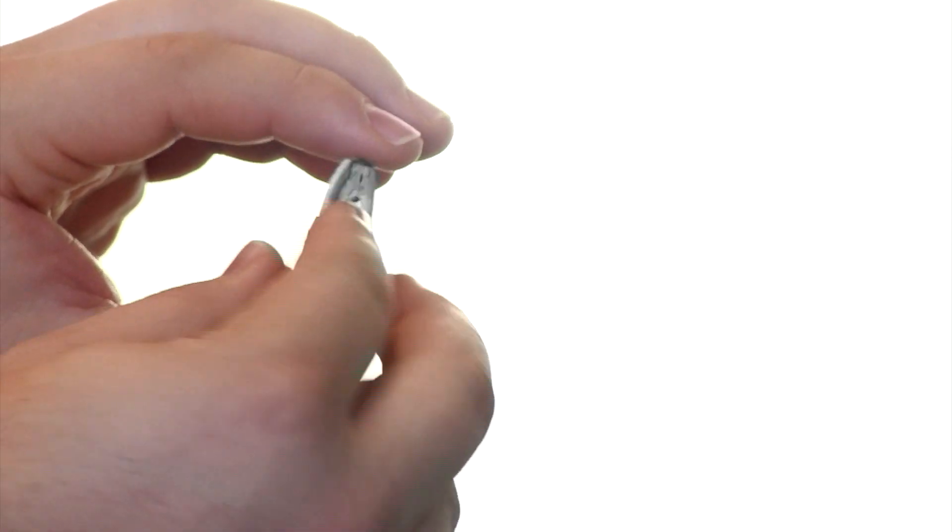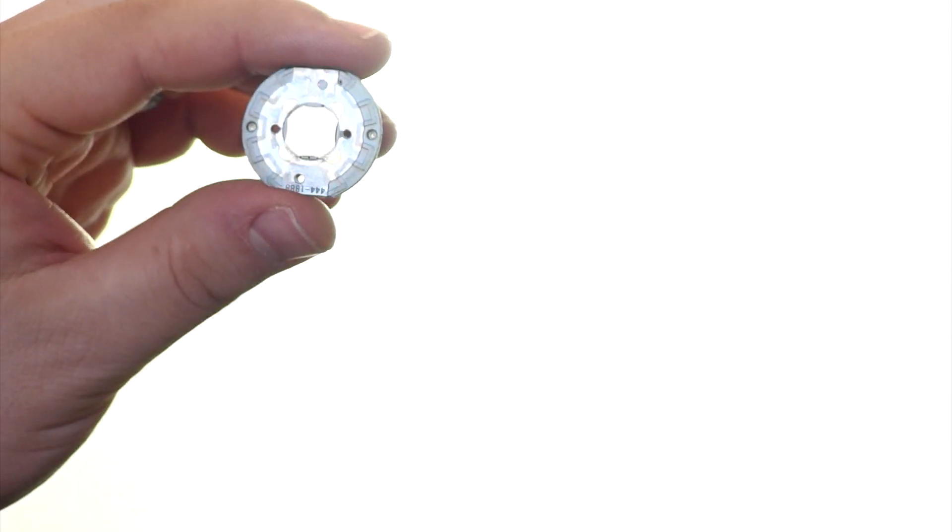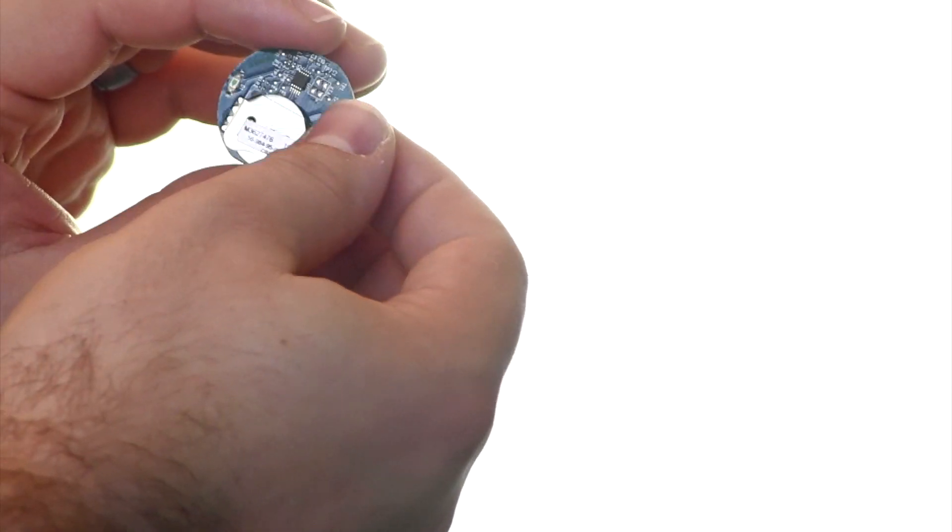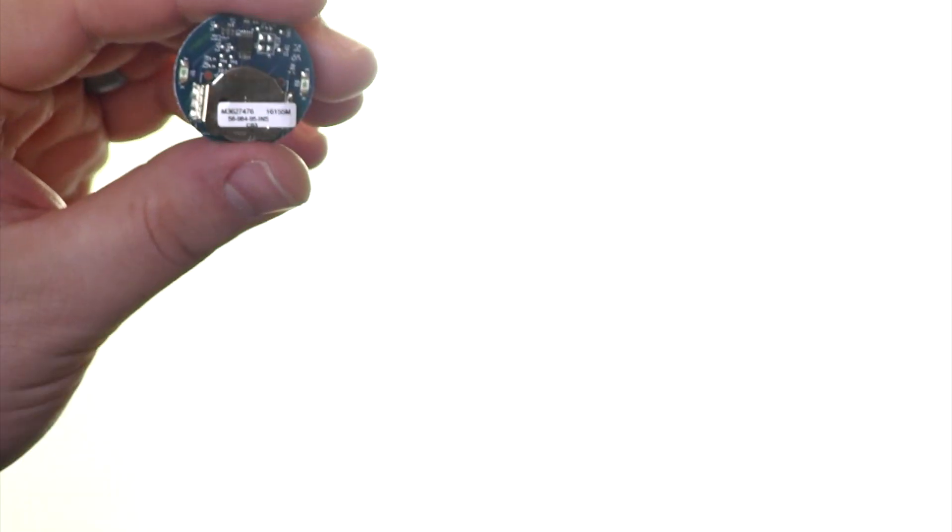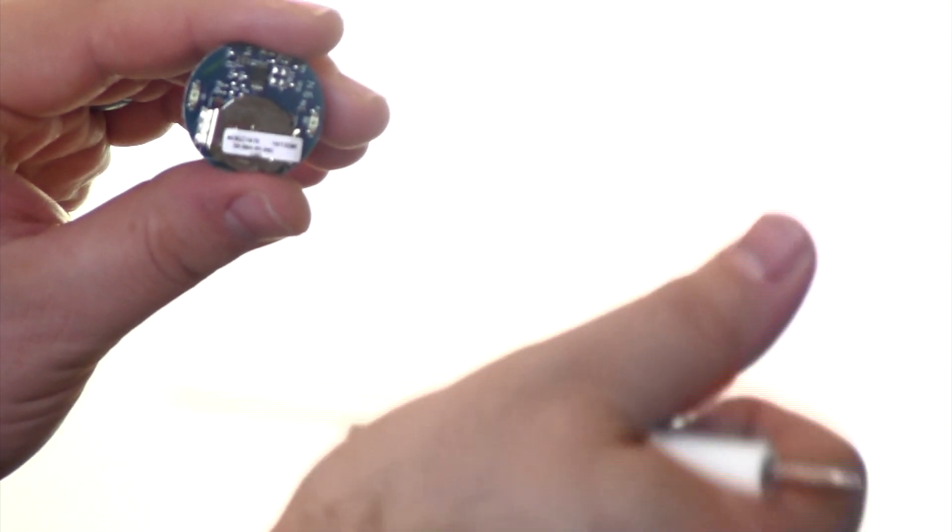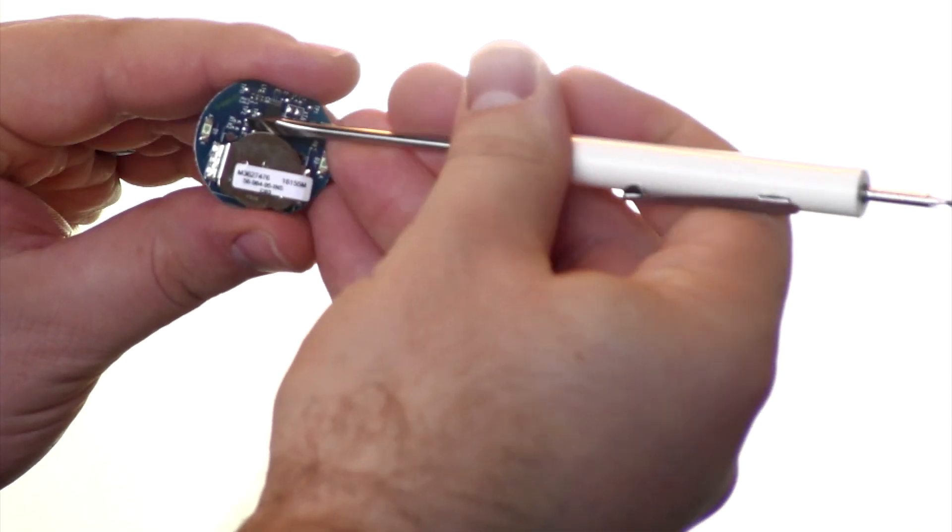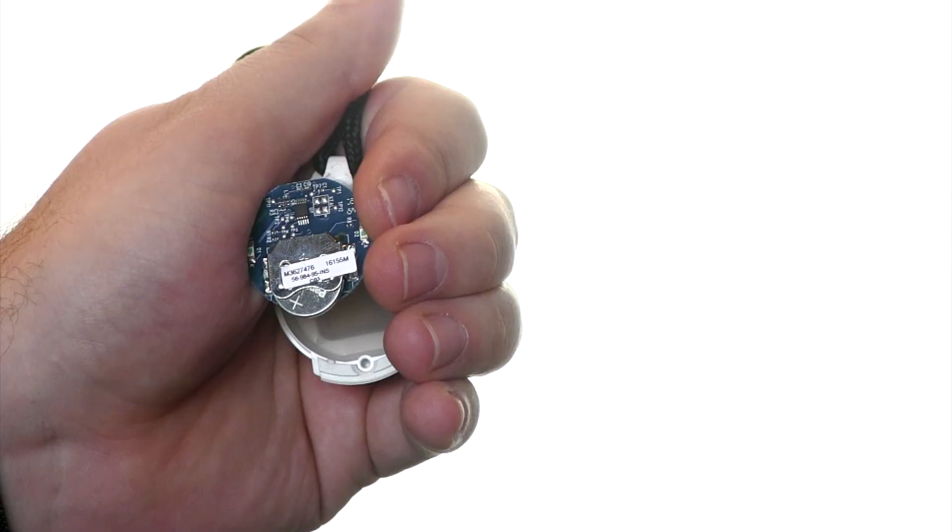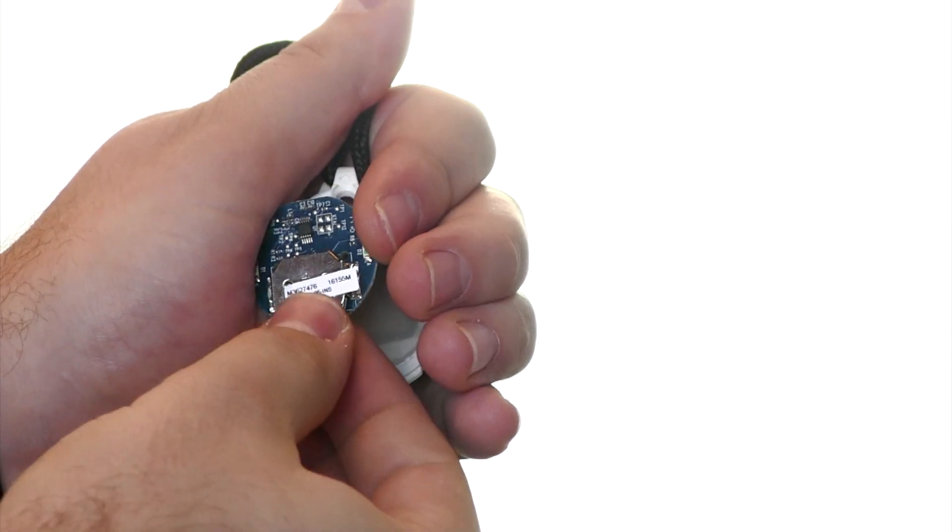The front of the device will be where the button is located and the back of the device will have the battery. To remove the battery, we want to press down from the top, forcing the battery out.